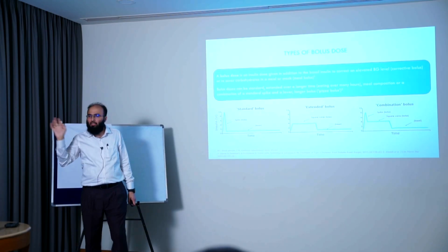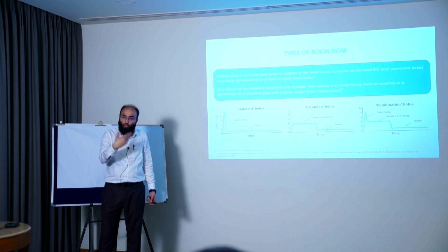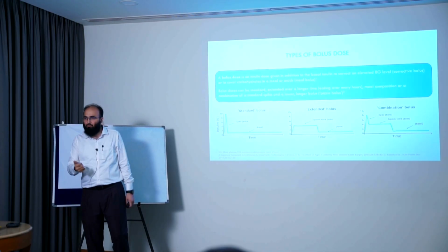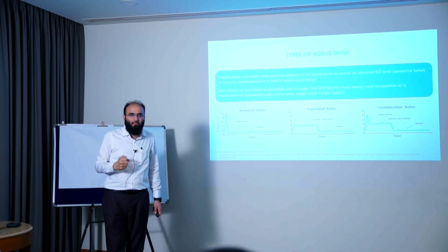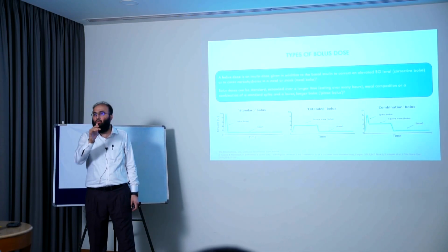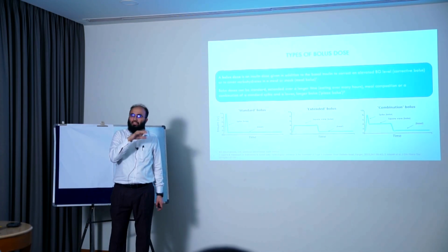Correction can be done afterwards. And say for example, you forgot to give the bolus, and after 30 minutes the patient remembers, I didn't have my bolus insulin. What is to be done? So if it is within 30 minutes, then you give half the planned dose. If the patient was supposed to input 100 grams, now you input at least 50 grams.